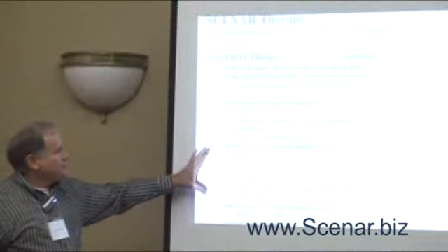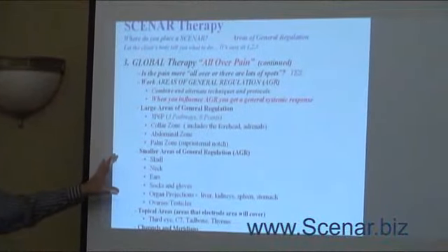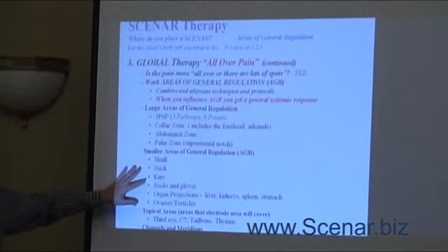There are smaller zones where you can just place an electrode, say at the thymus, for example, C7, the little projection of the prominent spine point that sticks out in people's necks. So those are the large areas, but there are also smaller areas on the skull, using some of the attachments you can use, the neck, the ears.